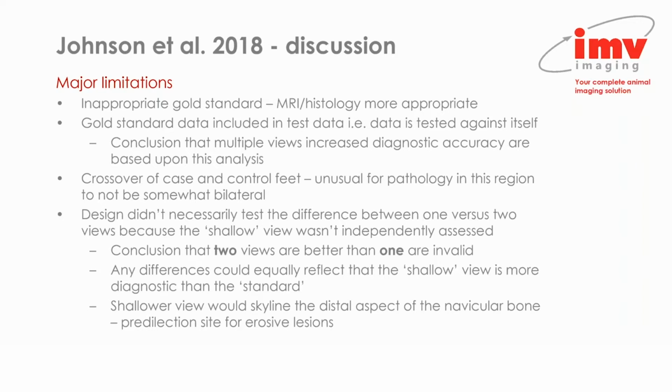We know that there are erosive lesions that can be detected on MRI and also gross pathology or histology that aren't radiographically visible. And so it is possible that some of the control horses did actually have erosive lesions that simply weren't recognized based on the gold standard of radiography.